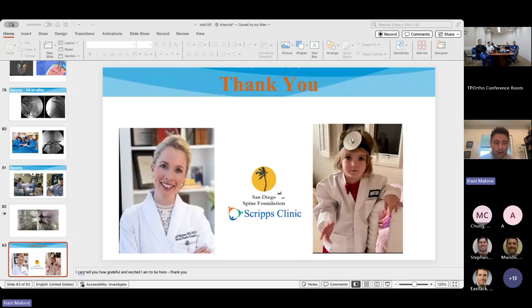And I think a lot of the negativity around TLIF is not necessarily just the operation itself, but the way it's performed. You'll hear guys when you're out in practice say, oh, it takes you 4 hours to do a TLIF, I can do it in 90 minutes. Well, I can do it in 90 minutes too. It's not that I don't know how to put in screws or use a curette. It's just that if you're going to get a good disc prep and create enough looseness to get some lordosis, it takes time. And that's okay as long as they're tolerating the anesthesia.